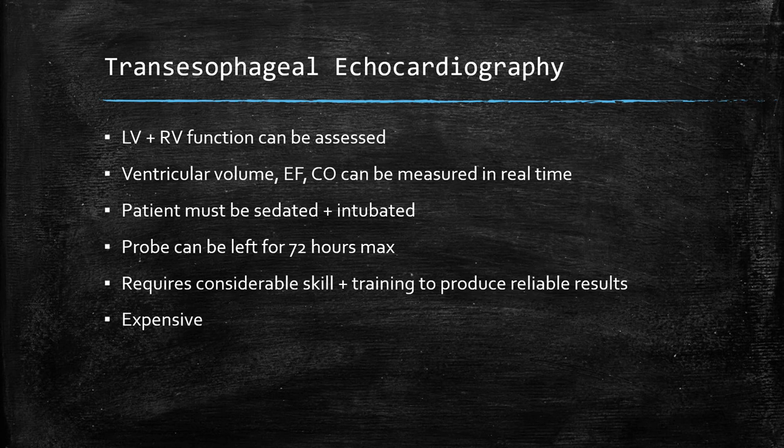Continuous transesophageal echocardiography is the monitoring technique that gives us the best information regarding left ventricular end diastolic volume, ejection fraction, and cardiac output. But it also has multiple limitations. The patients must be sedated and intubated, and the probe can only be left in place for a maximum of 72 hours, or else you risk esophageal necrosis. The devices are very expensive, and their use requires considerable skill and training to produce reliable results.